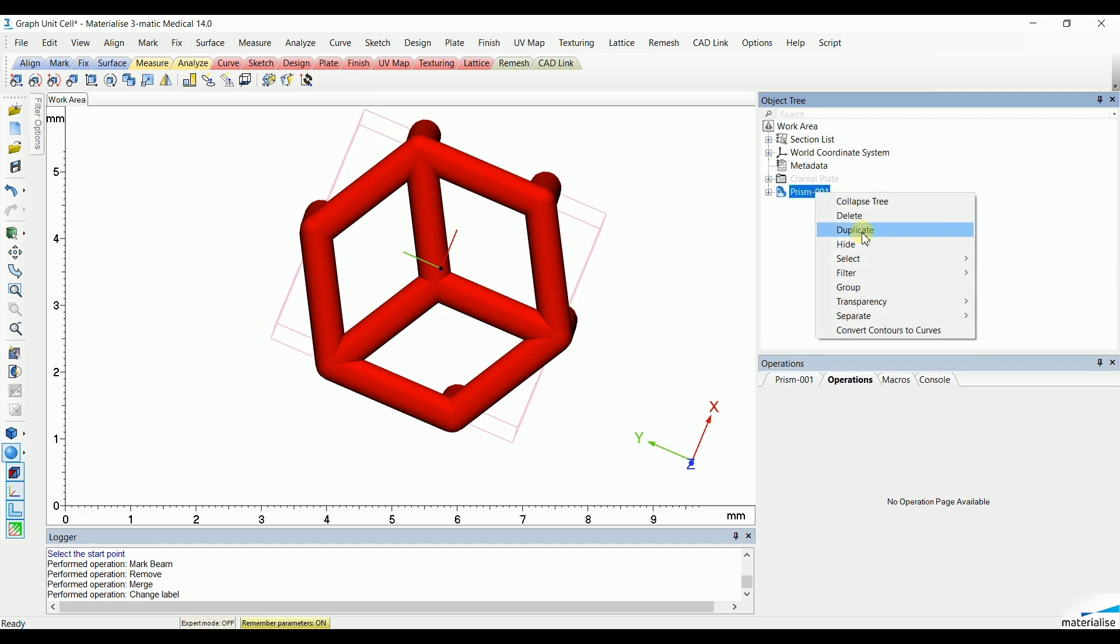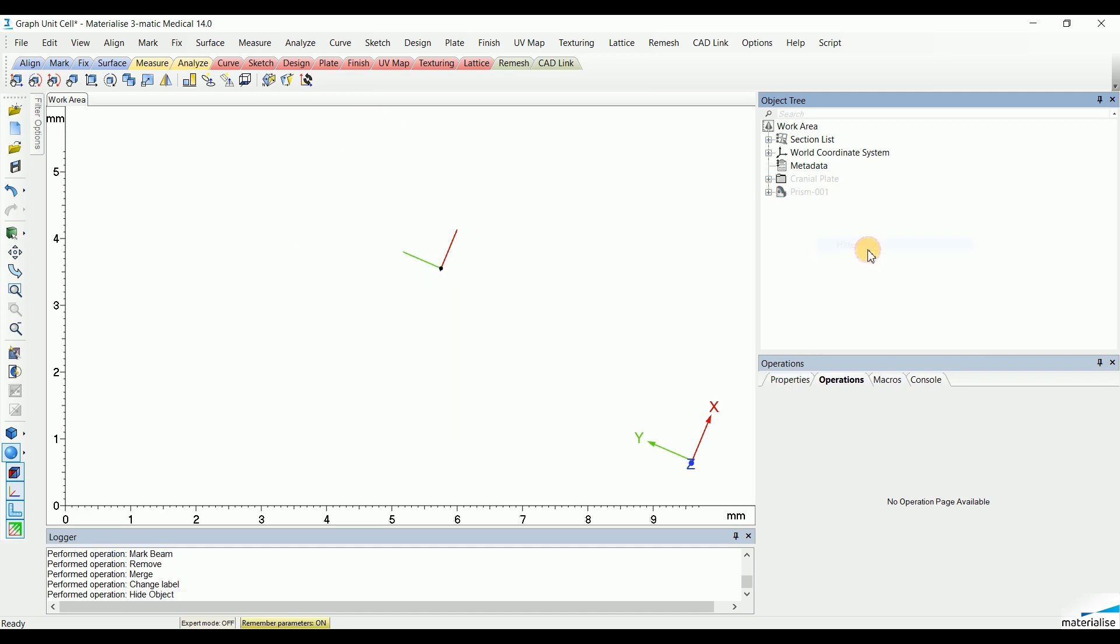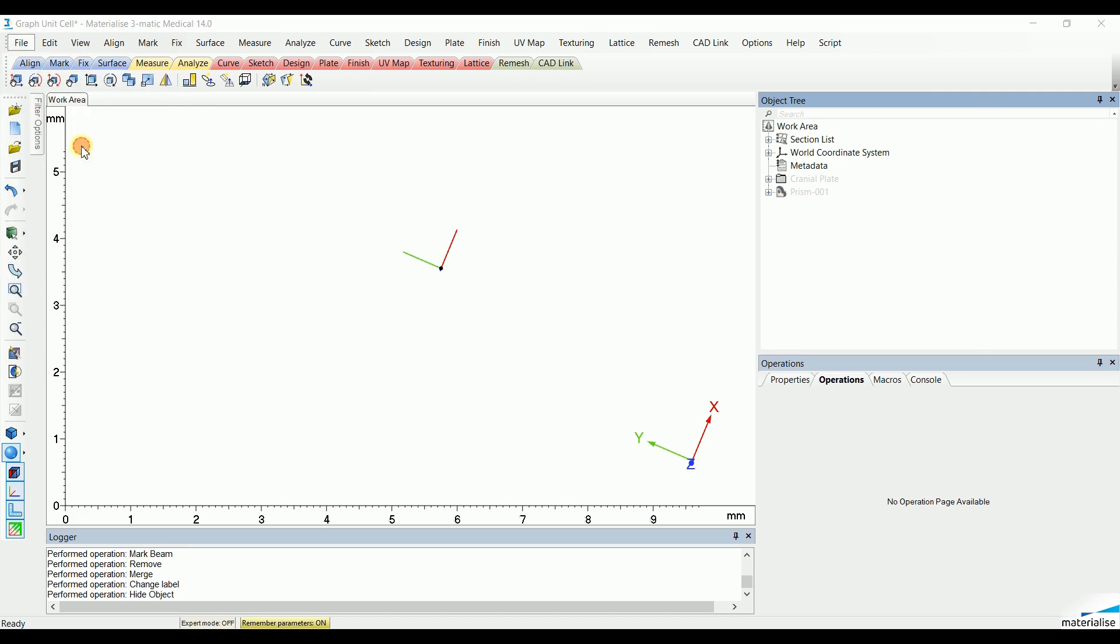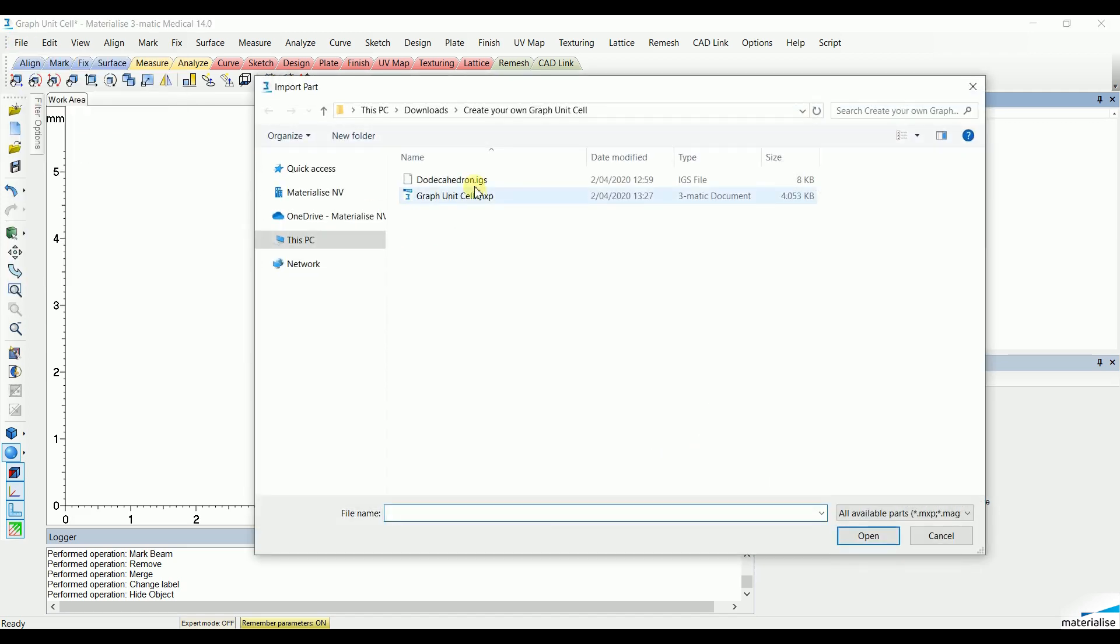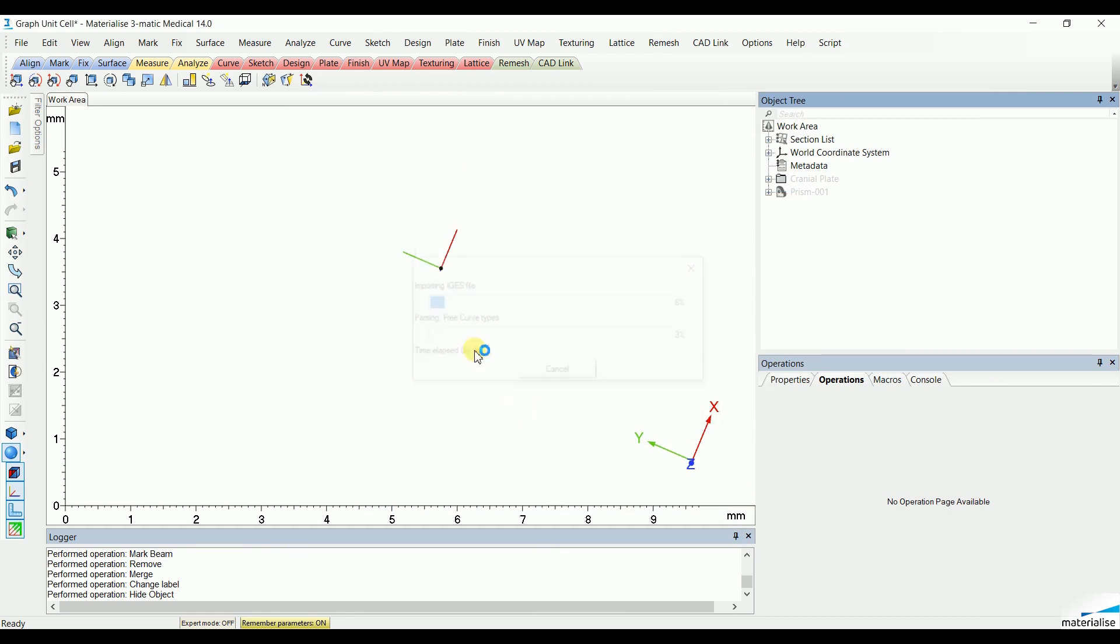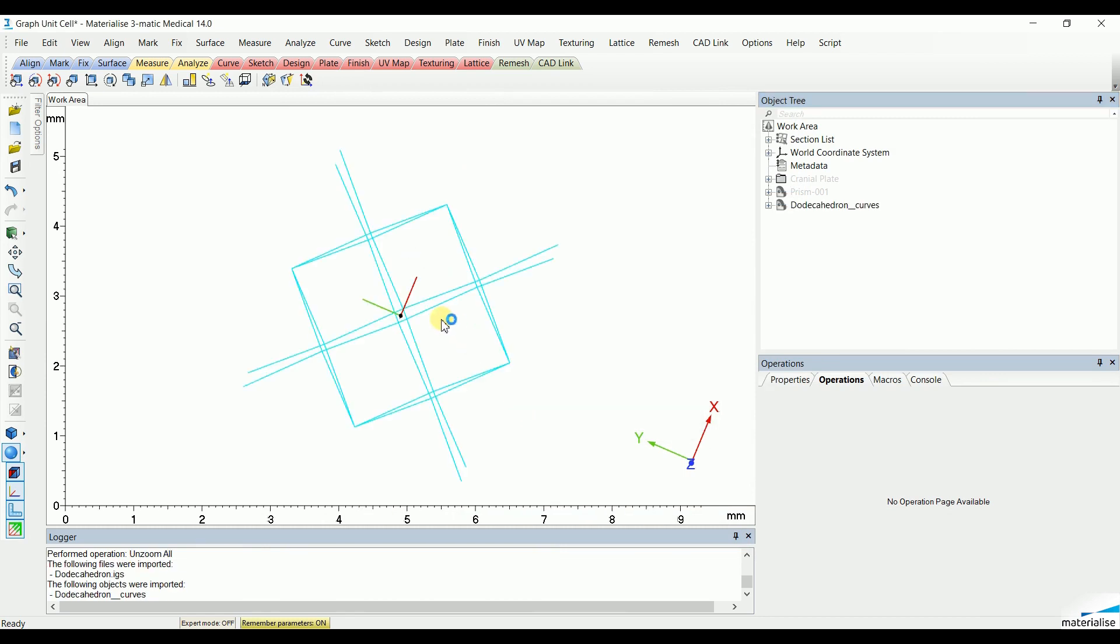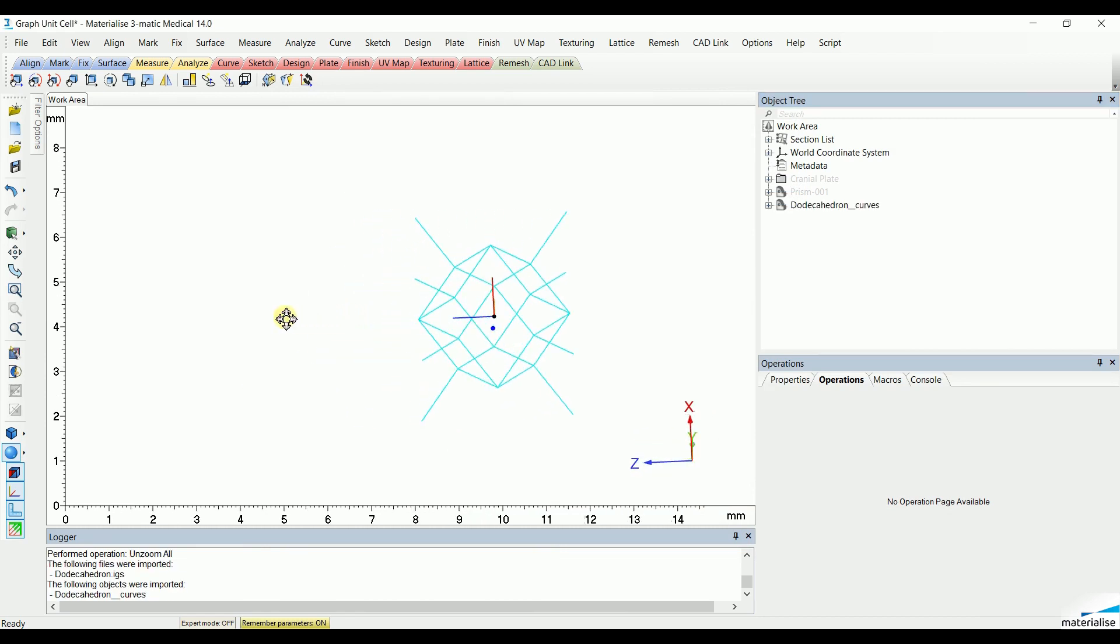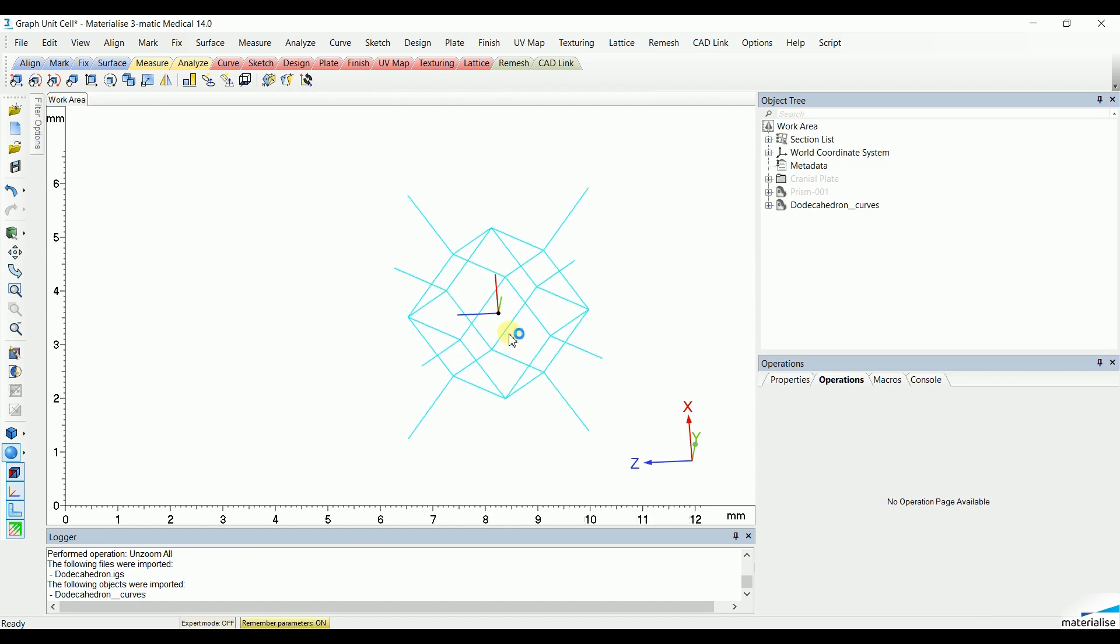A second method is to import an IGES file that already contains the curves that create the skeleton of the graph unit cell. In this case, a dodecahedron. You can already see that the curves are created and this can be done, for example, in another type of CAD software.